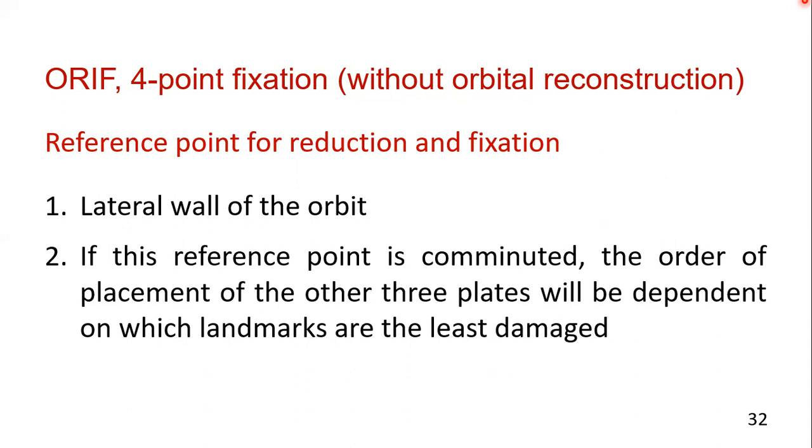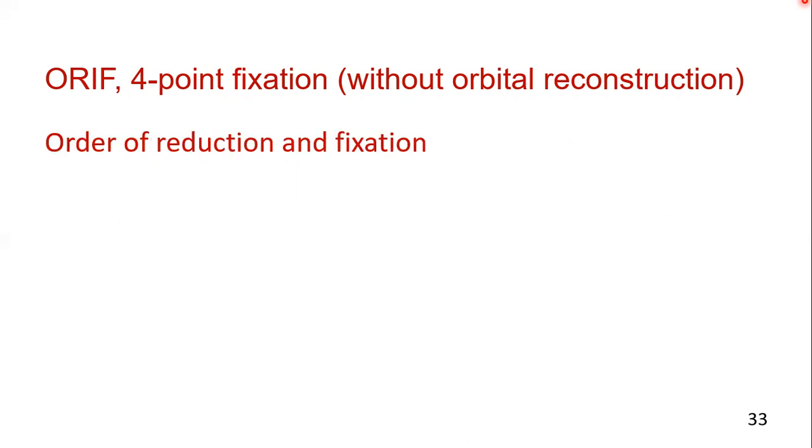If this reference point is comminuted, then the order of placement of the other three plates will depend upon the landmarks that are least damaged. The zygomatic arch may be an excellent reference as to whether the proper AP projection of the midface has been restored. However, in cases where the arch has been fractured and displaced at several different levels, the use of the arch to reposition the zygoma may be less reliable.